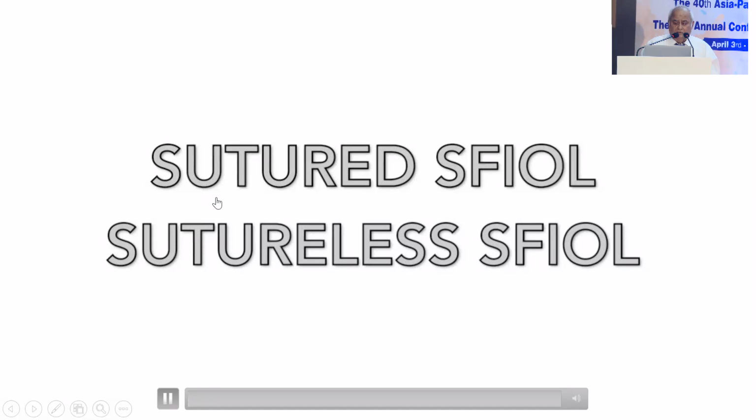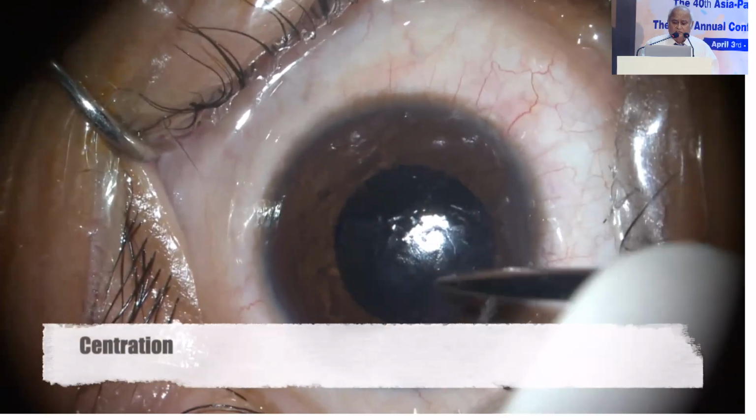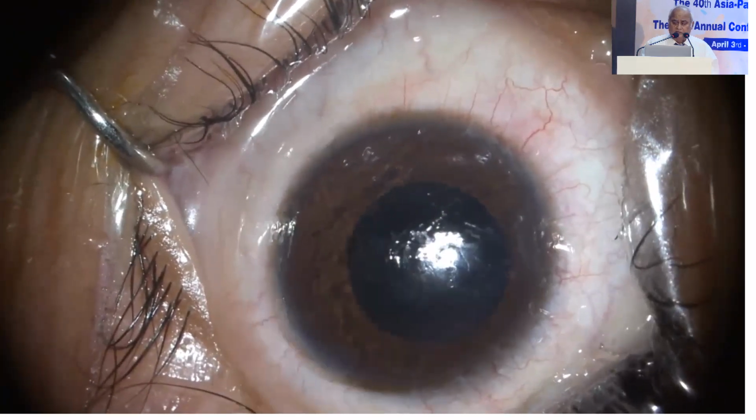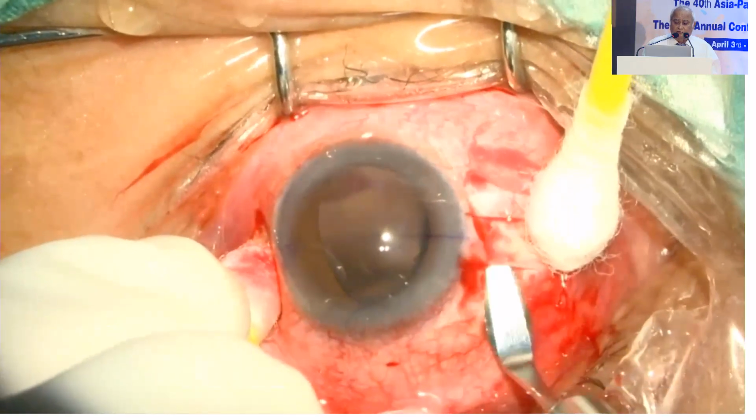This is one scleral fixated IOL. I have not done this surgery, it was done by Dr. Pranav, and this is what I requested him to give to me.